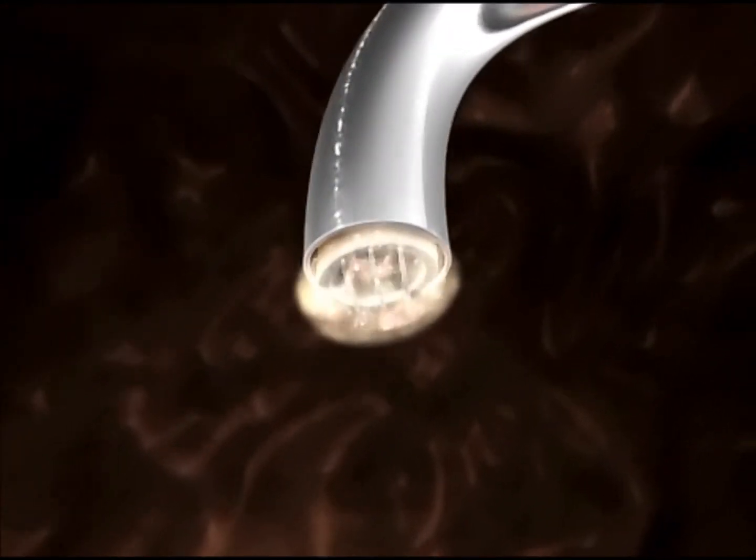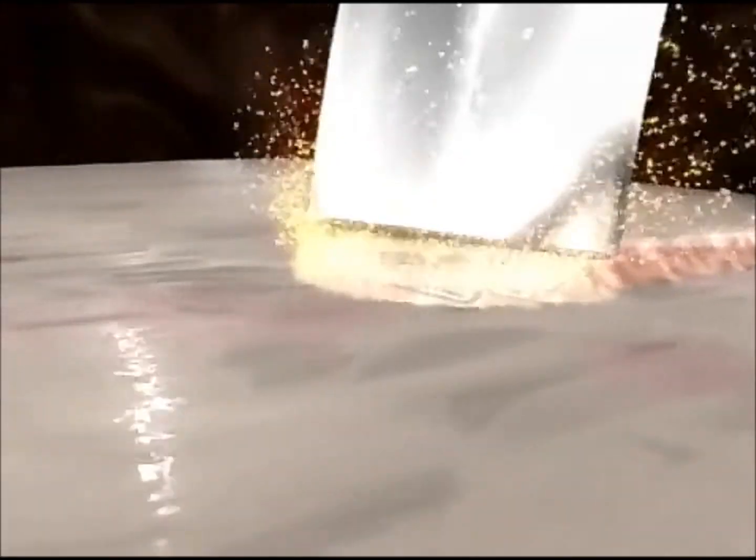This graphic demonstrates the ArthroCare Ambient, which is a plasma field that accurately removes tissues at a low temperature. Not only that, but it also seals the blood vessels seen in the graphic here, so that you don't get bleeding into the joint.